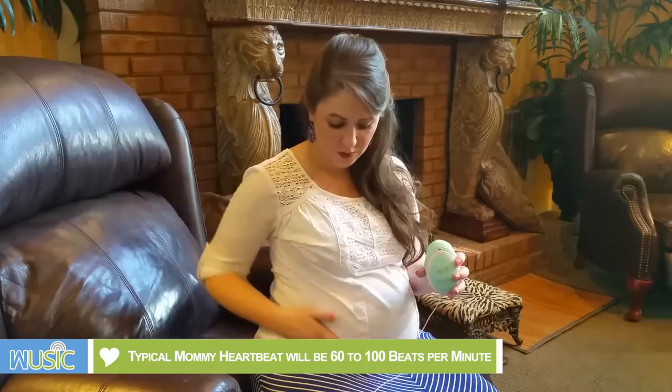I want to do a quick video on how to actually find the baby's heartbeat and to determine between baby's heartbeat and mommy's heartbeat. Mom's heartbeat is typically slower and is usually 60 to 100 beats per minute, and you'll find closer on the sides.